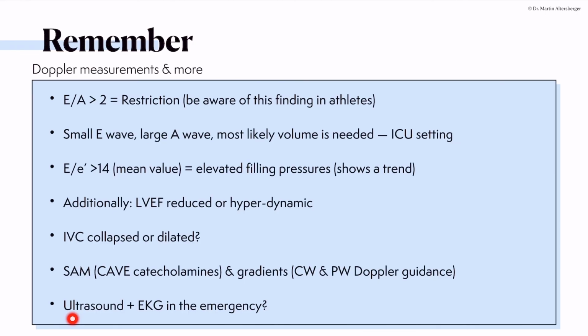And one thing I want to discuss, in our emergency setting, we very often use ultrasound with also ECG, but as you can see, we not always use it, but I would still recommend it all the time you're scanning a patient. When you think about placing an ECG, you have to remember doing it.